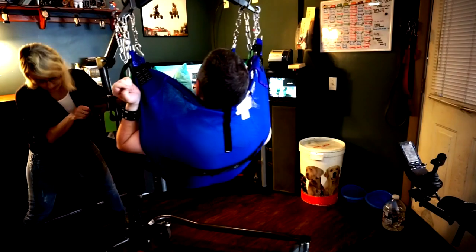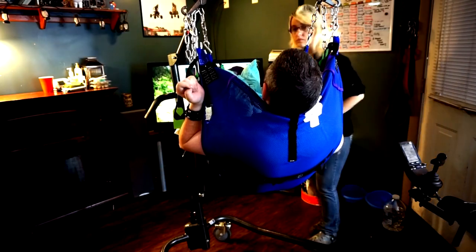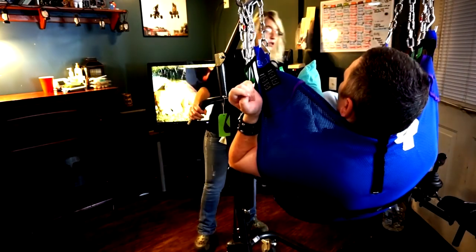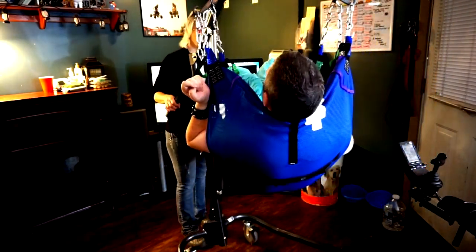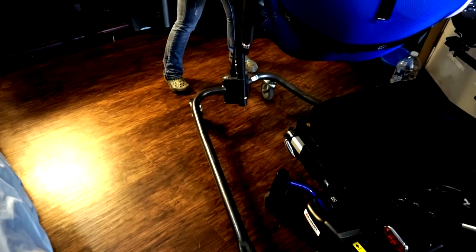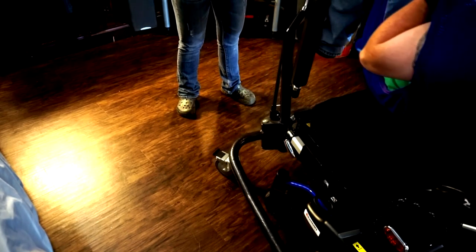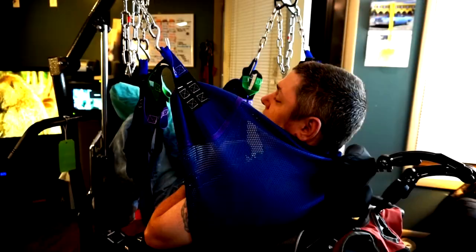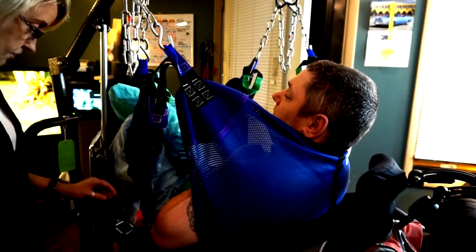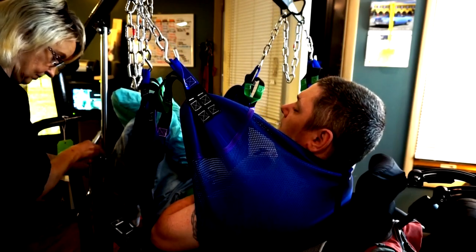I move over my chair and the wheels spread out just far enough that it reaches around my chair. I have to go through the front of this chair, which I'm really not a fan of — it's really awkward trying to get in this chair. I have to tilt my chair back just a little bit so my butt touches the cushion.